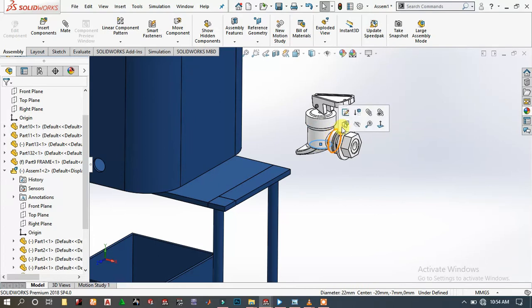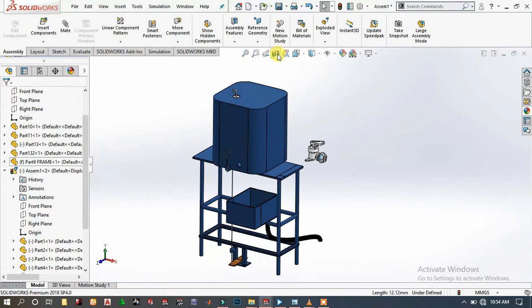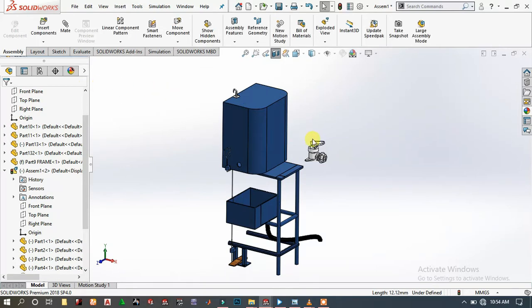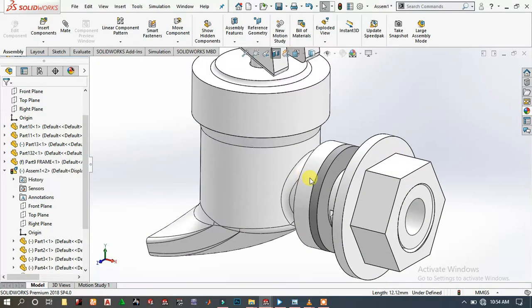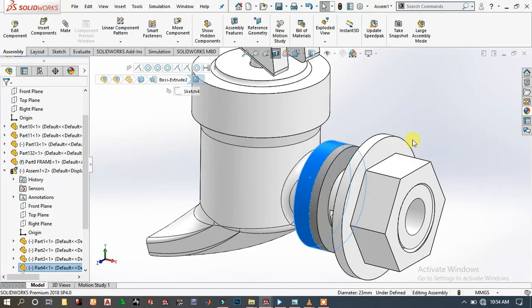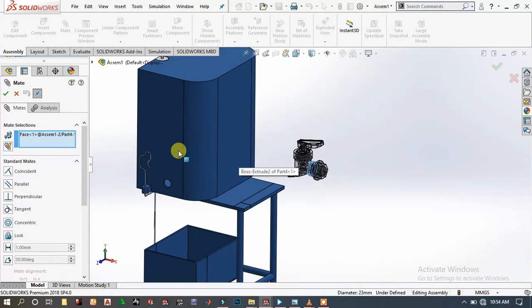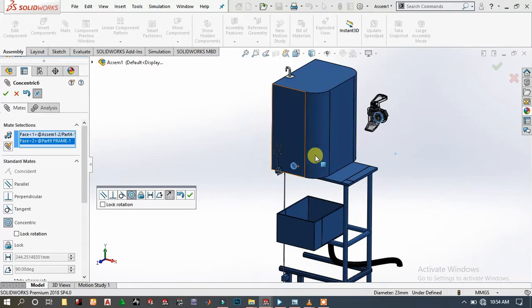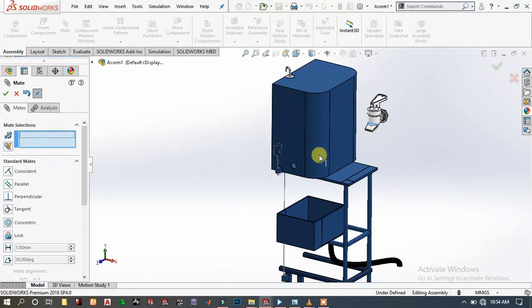Choose this and hide. Section this view and choose this circular face and mate with this circular face. Apply concentric mate. Then click OK. Drag it around here.